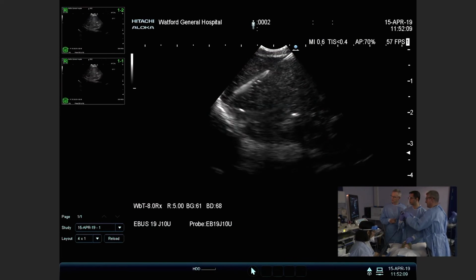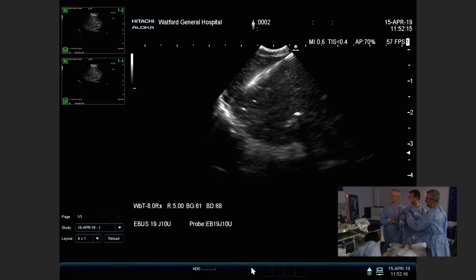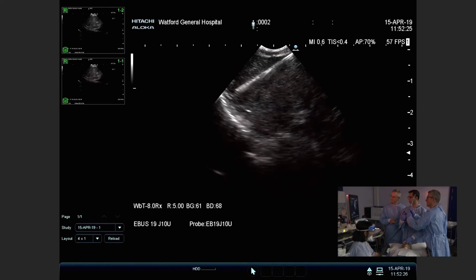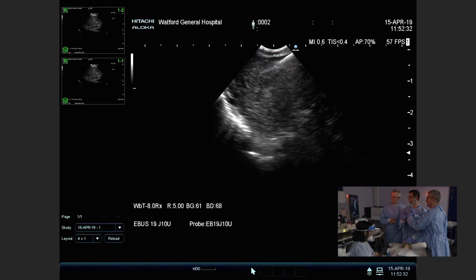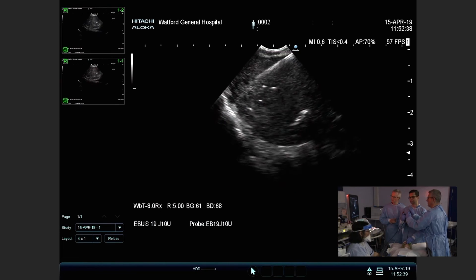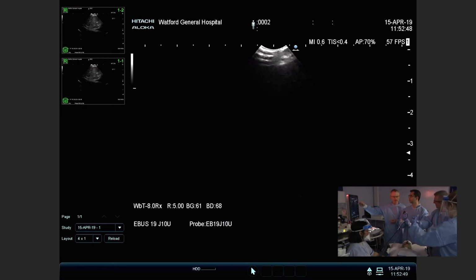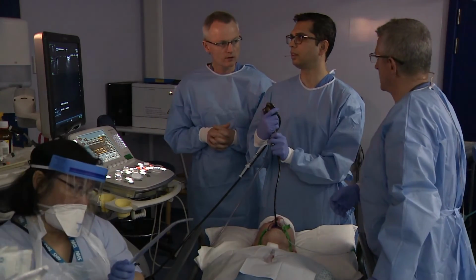So once again, I'm going to set the needle length so we cannot go beyond that point. In the EUS world, there's a technique where you can change different trajectories through the lymph node. I think we call it fanning. Fanning, but it would be very hard to do that. We can do it with a manipulation of the scope and the lever, up and down.